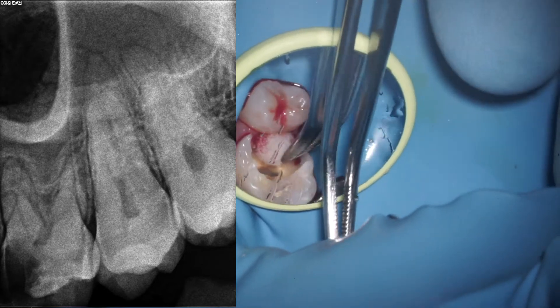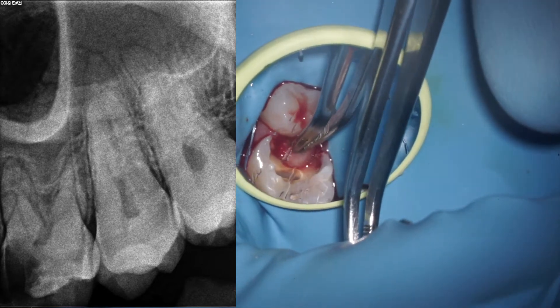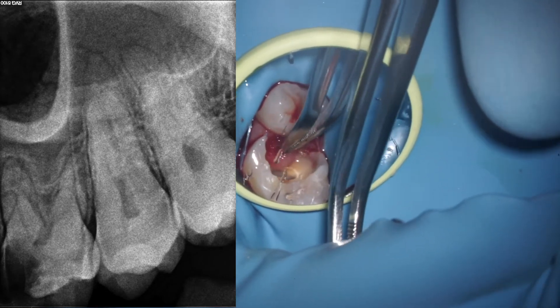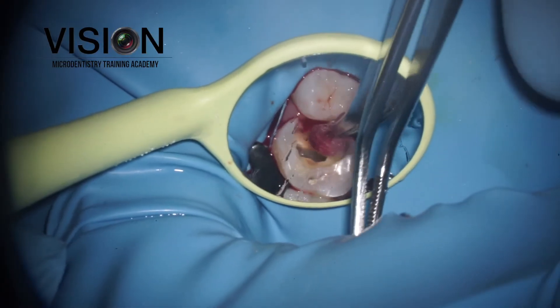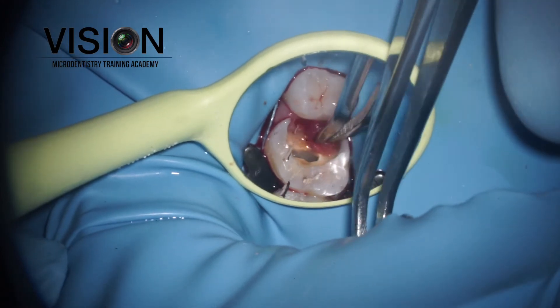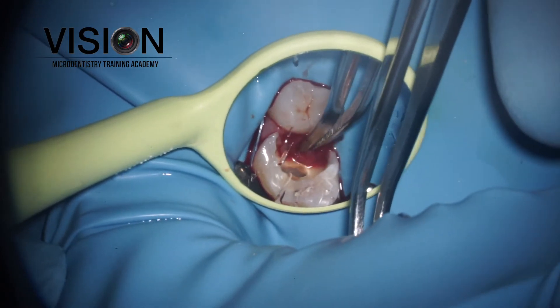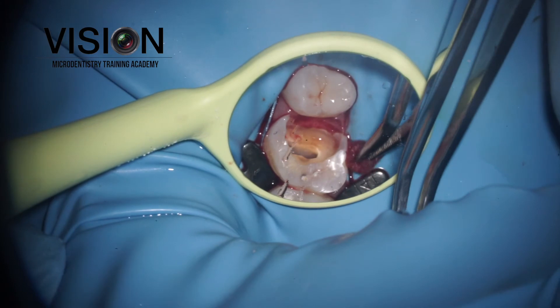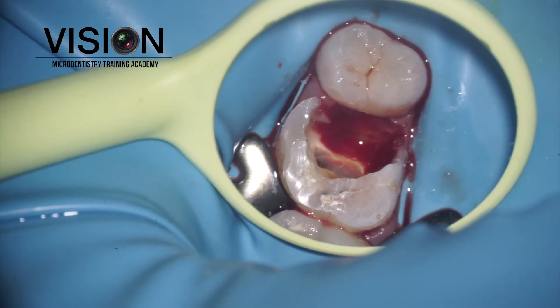As you can see in the preoperative radiograph, there was a deep caries lesion on the mesial side. As soon as we removed all the caries and got access into the pulp chamber, the interdental papilla, which was severely inflamed, started bleeding profusely. We tried to control the bleeding with some Allustat, but as you can see, the bleeding started immediately.